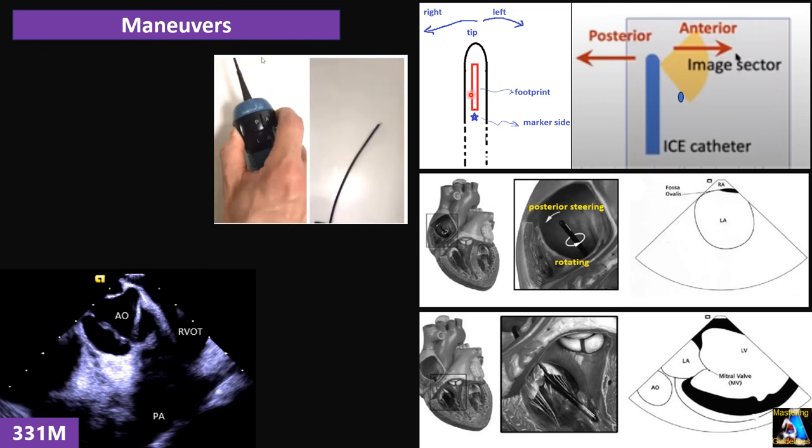However, in image D, once we're close to the eustachian ridge, we can demonstrate the difficulty in achieving adequate catheter contact at the subeustachian portion of the isthmus, limiting RF delivery. Image E shows a more lateral approach, which also is limited by the eustachian ridge movement and its prominence.